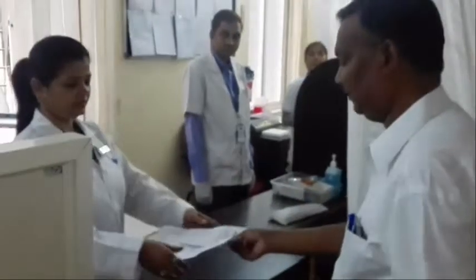We first start the process by receiving the patient's details. The doctor in charge will check over the details along with the patient's identification card. The doctor then confirms the patient with the photo and name by cross-checking the detail receipt along with the identification proof given by the patient.